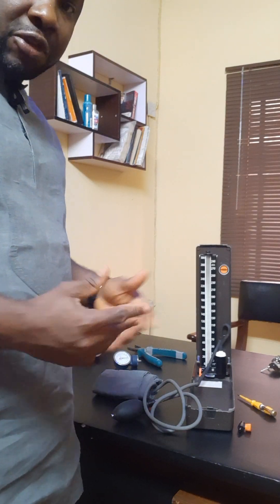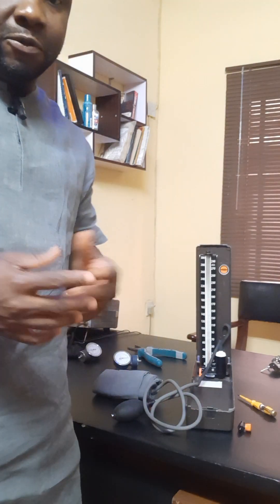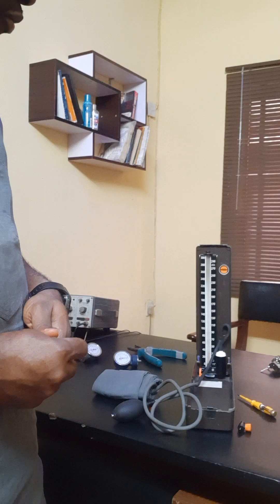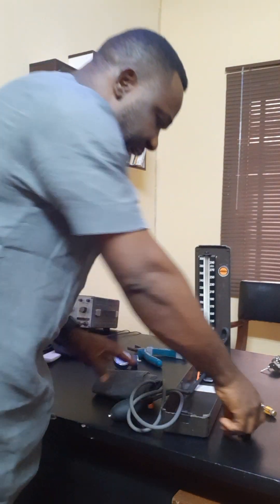I am going to take us on the process of finding the faults. This very machine here is malfunctioning. So we need to find out what is wrong with it.